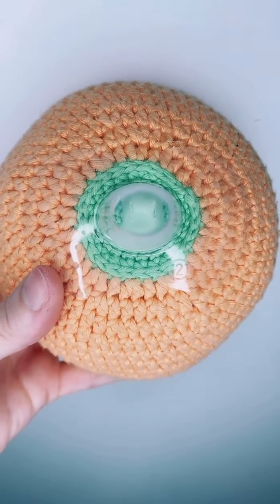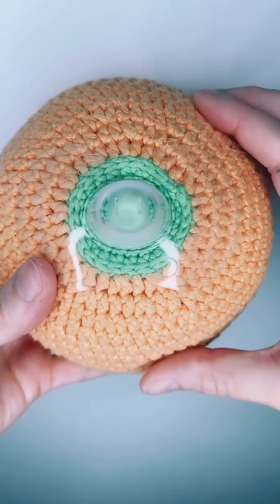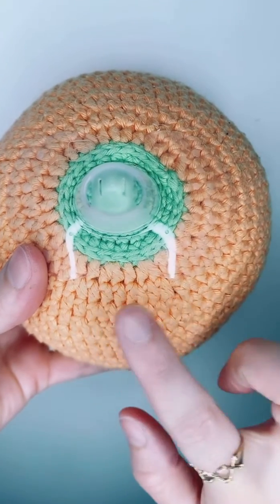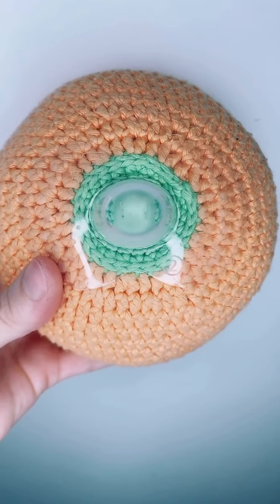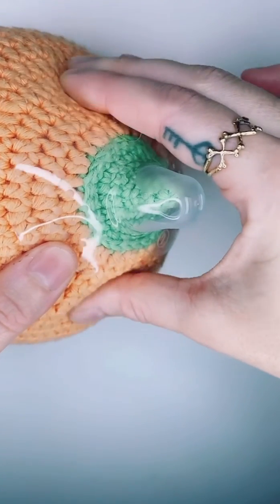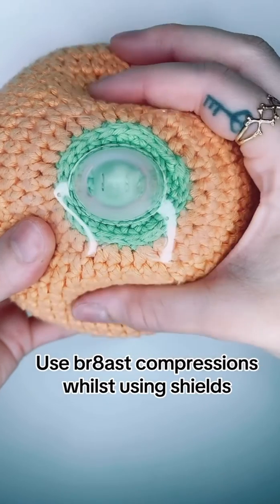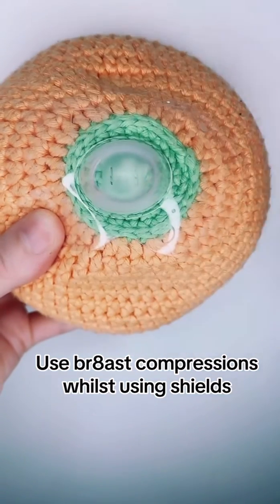When utilizing nipple shields, please always make sure that you are feeling around your breast after and during a feed to make sure that your breast is nice and healthy. There are no lumps and bumps or areas where the draining needs some extra help. Some babies will need to get used to how to latch efficiently on the shields and not just slip down and do nipple feeding. So sometimes it is helpful to use breast compressions as you are utilizing the shields.